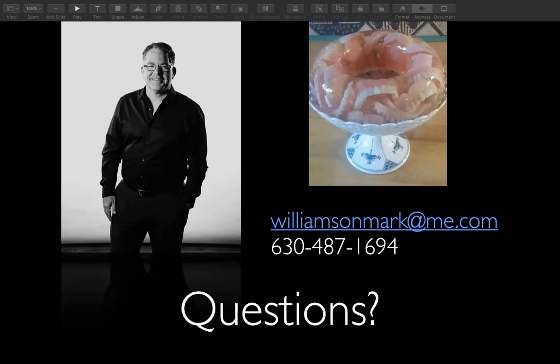We're probably doing maybe 5 to 10 cases a day like this that we're starting and choreographing and trying to decide, okay, what can we make? And we don't really make that decision until they take the final impression. We do a bite rim and verification jig, make sure our model impression's great, and then maybe even do some sort of diagnostic setup for them to try in. And once that's accepted, I can say, let me measure, let me scan this, let me see what sort of space they have, and let's come up with a plan of what we can make and what that's going to run.